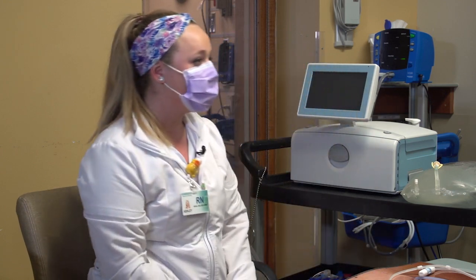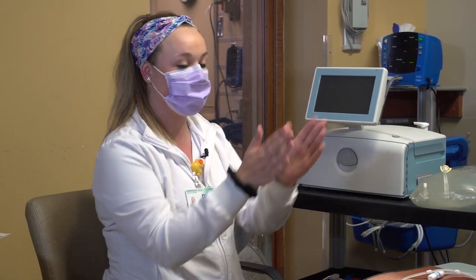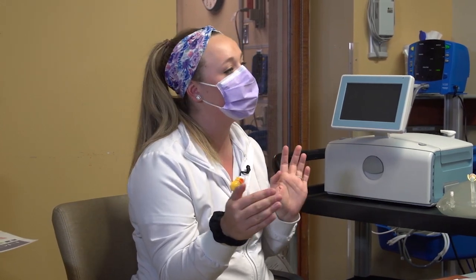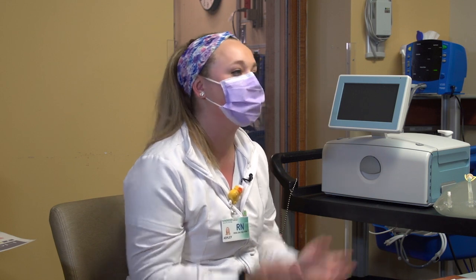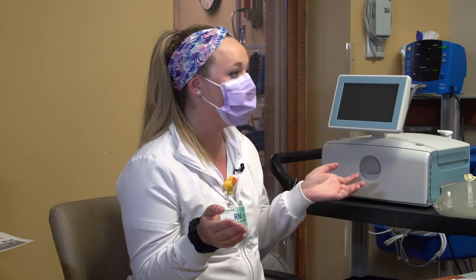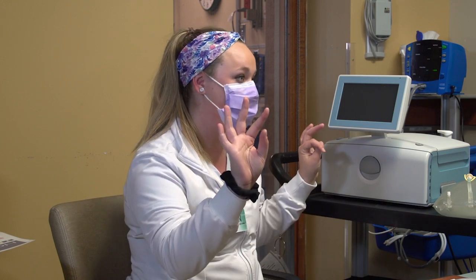I guess how much storage would you say? So on an estimate, we usually say on a wall maybe about 7 feet or so in length. It'll probably come out about a foot or two from that with those boxes, and then maybe about 4 feet high. That's just a rough estimate, but it'll give you a good idea of which area you would like to keep them in. You can always keep them stored separately too, as long as they're in a clean, dry area. That will also be acceptable if you have them in two different spaces.